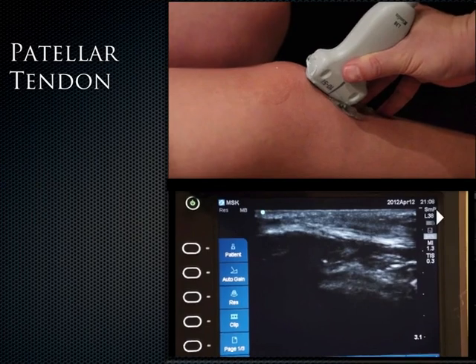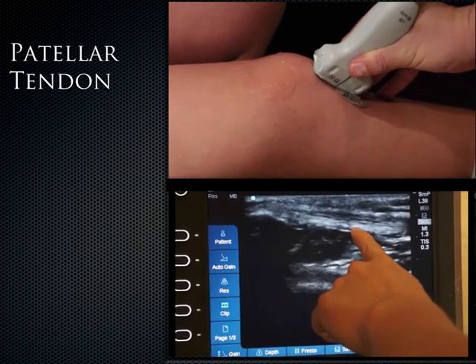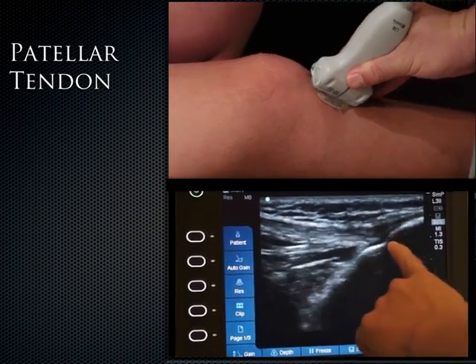So next we're going to take a long-axis view of the patellar tendon. It inserts on the inferior patella, and you can trace it with its fibrillar pattern all the way down until it actually inserts onto your tibial tuberosity right here. This is the tibia and the tibial tuberosity right here.